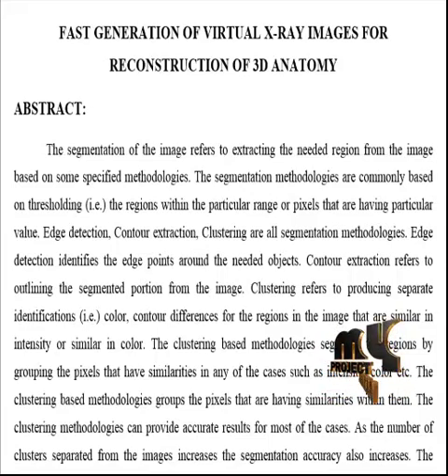Let's discuss the process of fast generation of virtual X-ray images for reconstruction of 3D anatomy. Let's see the abstract of the process. The segmentation of the image refers to extracting the needed regions from the images based on some specific methodologies.